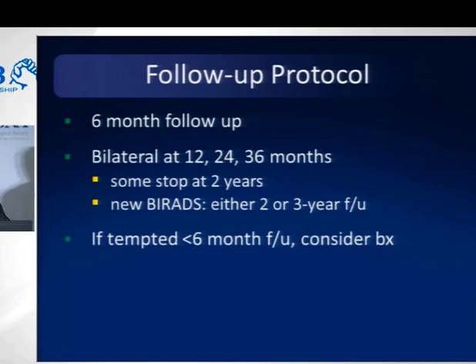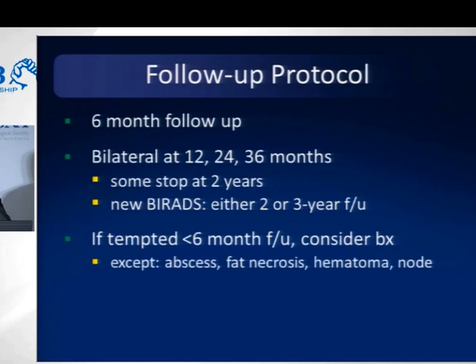So this is another little hard-won piece of information from a really difficult experience. Sometimes you're tempted to bring back a lesion a little bit earlier than 6 months. So you see a lesion, you think, it's probably benign, I'm going to bring that back. But you know, there's something about it, I don't want to wait a full 6 months, I'm going to bring it back in 3 months or 4 months. If you are tempted to bring back a lesion in less than 6 months, there's something about that lesion that's tipping you off that it is more suspicious than you think it is, and I would suggest that is a time to consider a biopsy. We've been burned in the past by those cases.